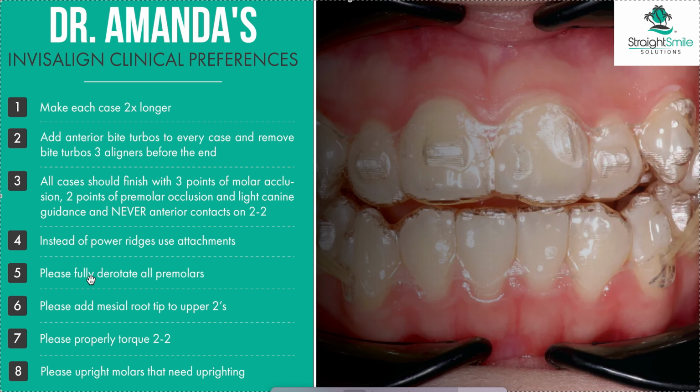So listen, I'm not here to have half-baked cases. I want the cases done right. Of course, there's a few circumstances where maybe we're doing some type of limited treatment. The patient has signed the right paperwork. They understand the risk, benefits, and alternatives for something very special. But that's a one-off. It's a very rare situation that I'm going to do those. So please fully derotate all premolars.